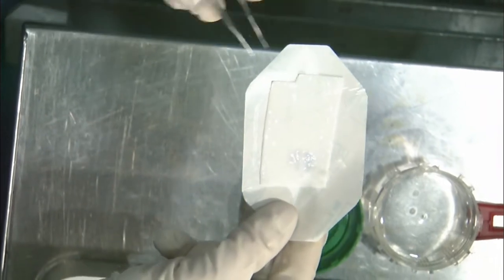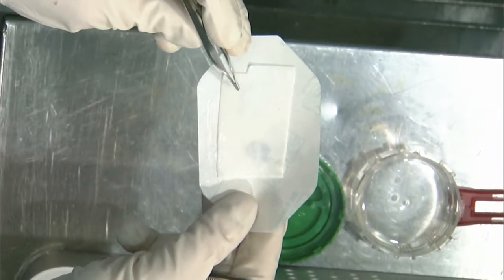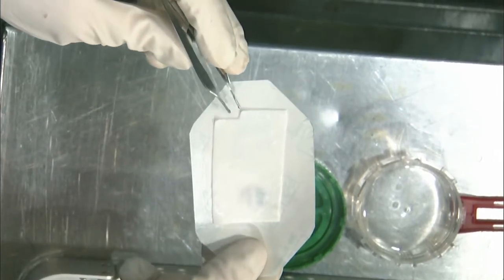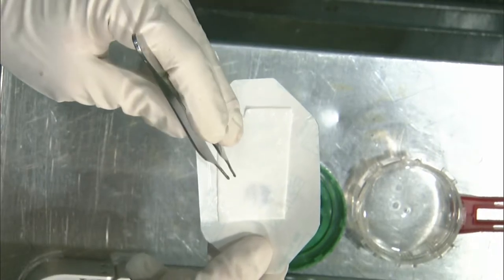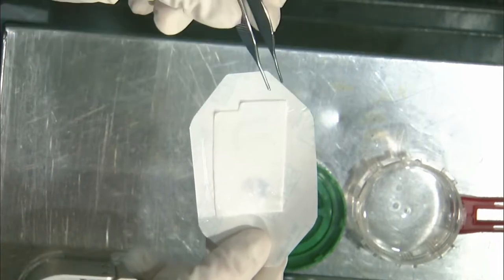Just a couple little pearls. You want to put this away. You want to kind of keep your cutout over here, so you don't want to put it right next to here, so that you're cutting out your orientation. Because if you happen to need another one, something changes, it moves, you still understand where your cell side is and what is not your cell side. There's a big difference between the cell side and the non-cell side.